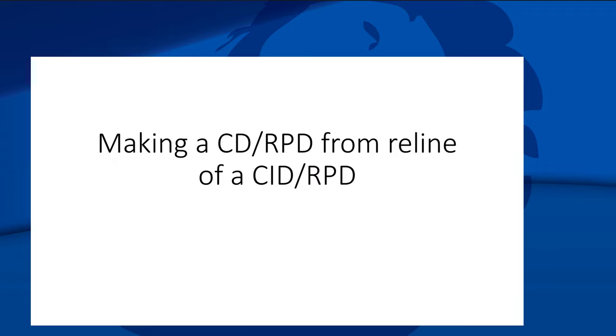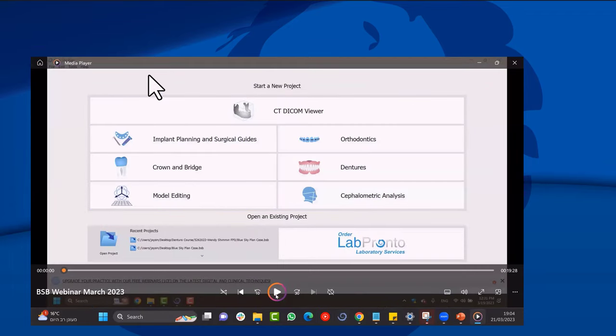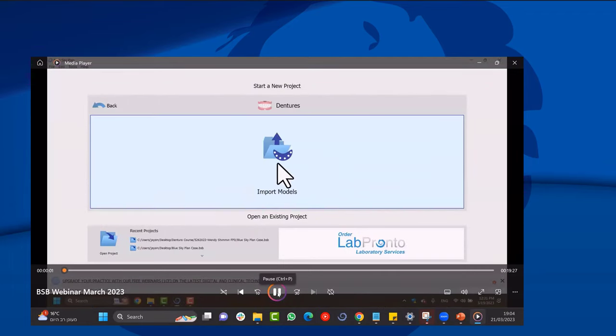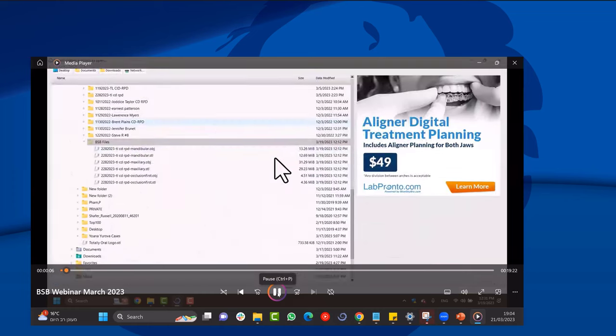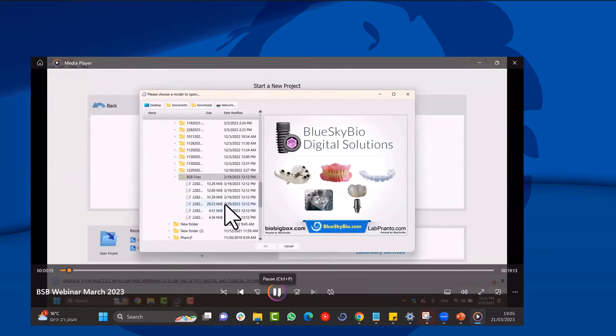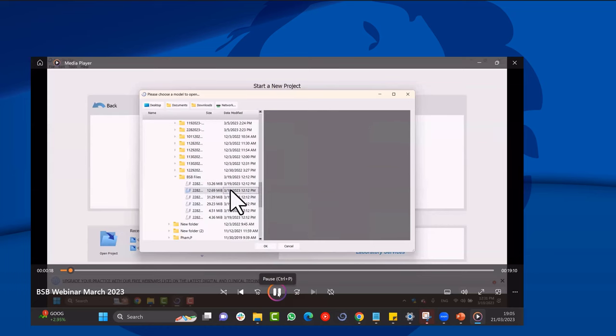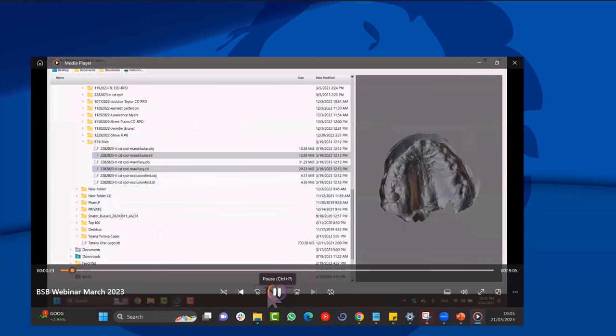Now I'll go through a video I did earlier — using the latest version of Blue Sky Plan to make an upper denture and lower partial for a patient from impressions scanned with the Medit i500.